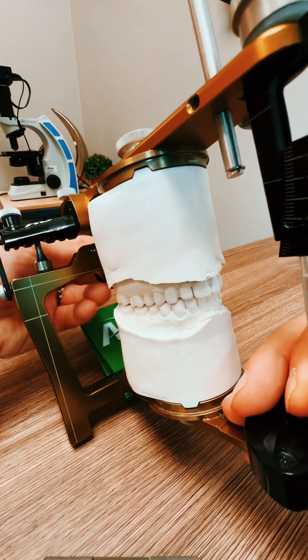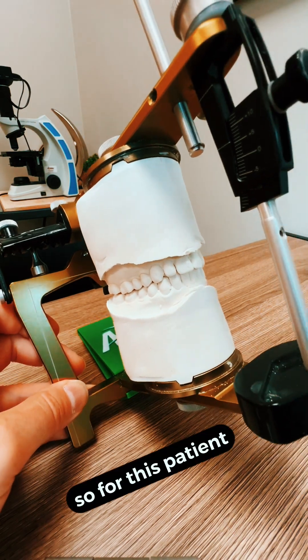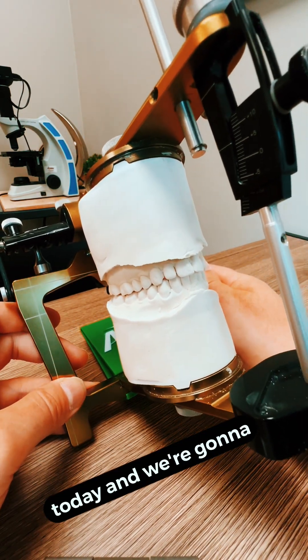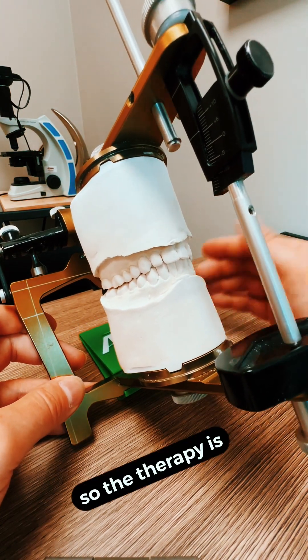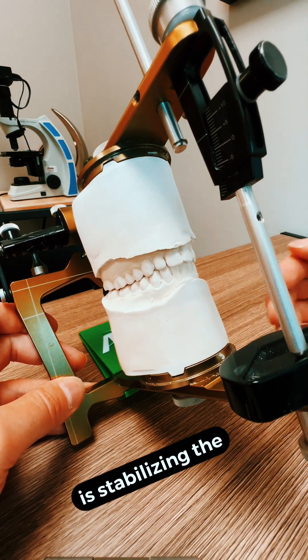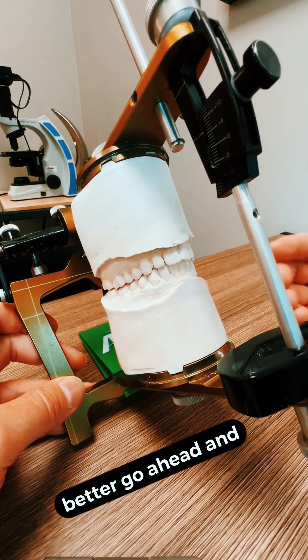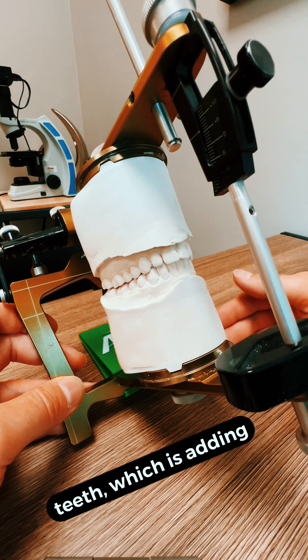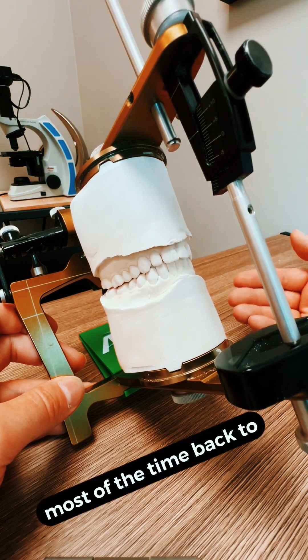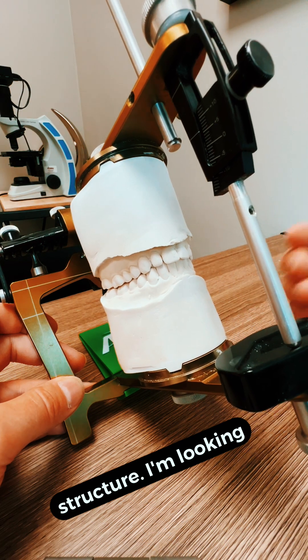You can recreate movements of the teeth and see where wear patterns are. For this patient, she's actually coming in today and we're going to start occlusal therapy. Occlusal therapy is basically step one, which is stabilizing the bite, stabilizing the jaw, stabilizing the teeth. And then when everything's stable and she's feeling better, we go ahead and actually restore the teeth — which is adding back, most of the time, structure that's lost, or aesthetically enhancing the smile for the patient.